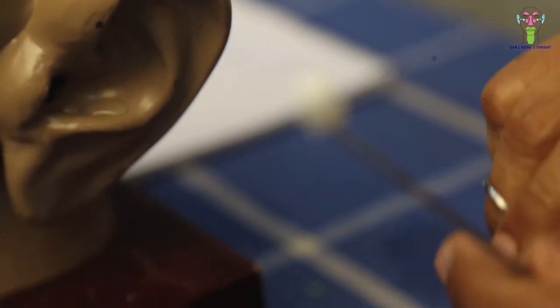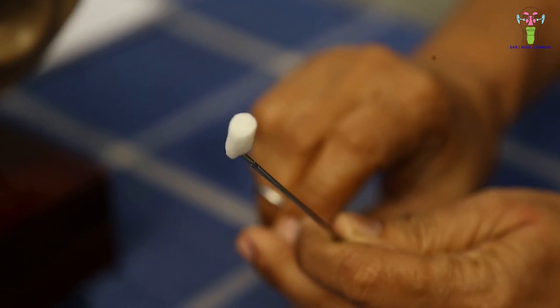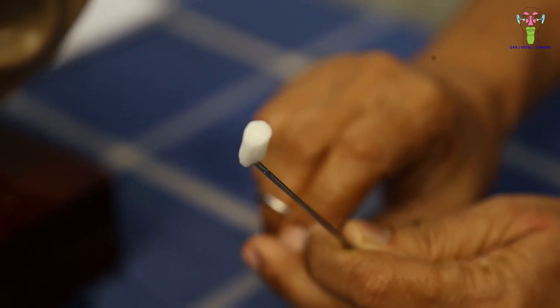So you can see how it has enlarged with water. Thank you.